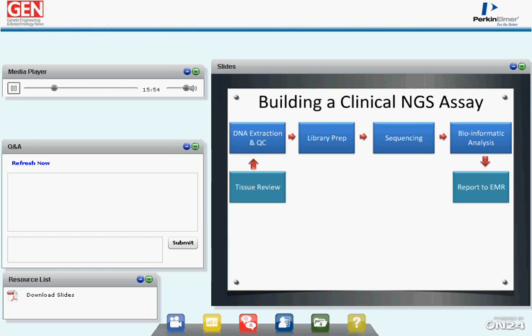On the sequencing side, this is now taking those fragments that have been enriched and turning them into digital data, the process of sequencing. And this is really what revolutionized this field. These new sequencers, these machines, are able to sequence millions to billions of individual DNA molecules, resulting in a very large amount of data, which is where the bioinformatic analysis comes in.